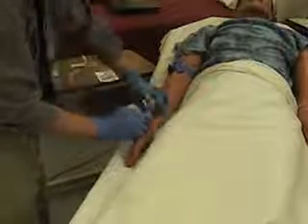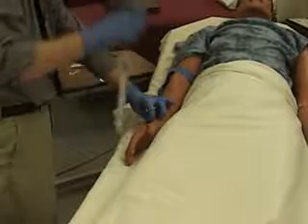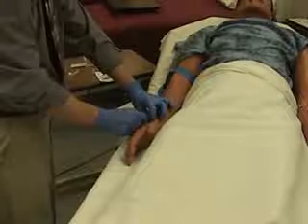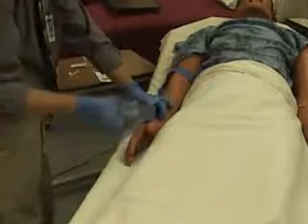Occlude the vein above the catheter with your non-dominant hand, then you can release the tourniquet. Pull the needle from the catheter, ensuring the needle's safety device engages. Attach the lock and syringe to the catheter with your dominant hand. Make sure the luer lock is tightly secured.